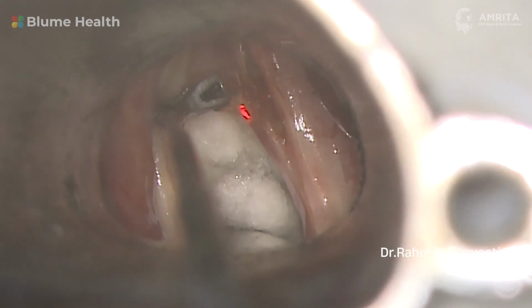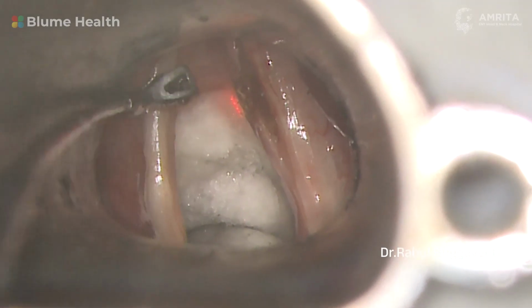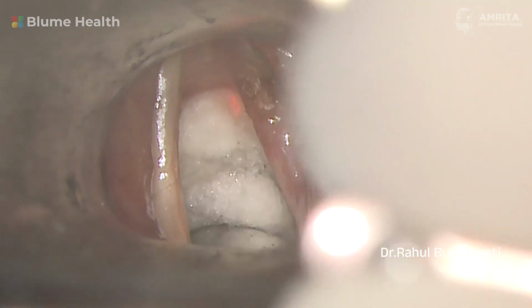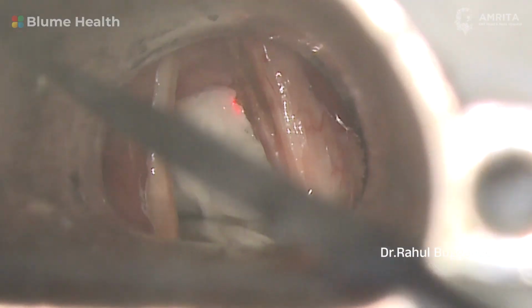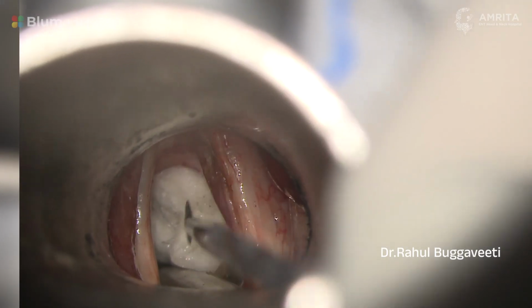So part of the mucosa is being removed along with the cyst wall, the last part. And that is the defect after completion of surgery. Since the vocal ligament is not damaged, it will heal by second intention and the scarring will be less, and the post-op voice results are far superior.